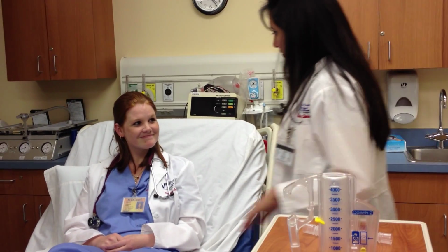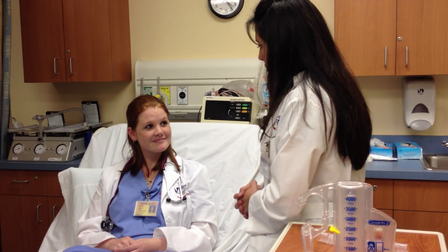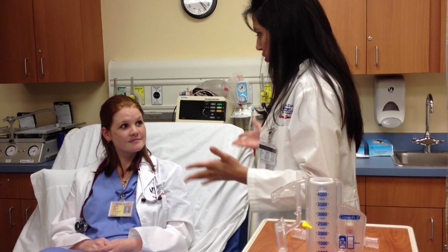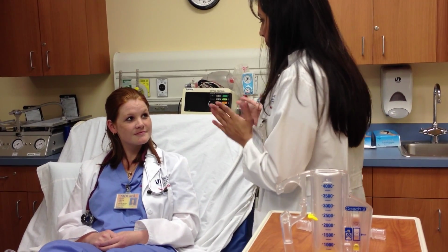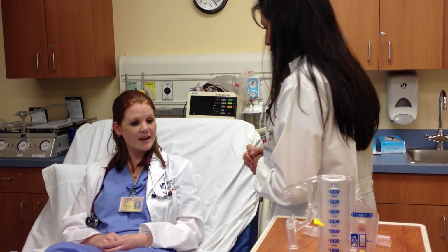Hi Krista, my name is Evelyn. I'm here as a respiratory therapist student, and I'm going to show you how to use this breathing device called incentive spirometry. I see you're going to have an abdominal surgery, but first, before I go on, I'm going to wash my hands, and I'm going to demonstrate to you how to use this, okay, for your recovery.